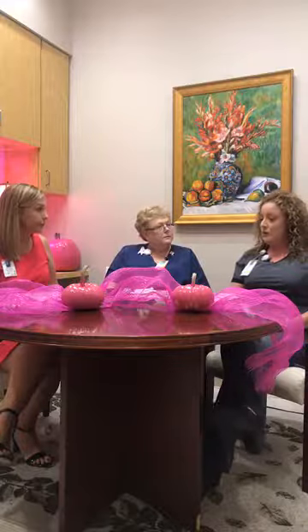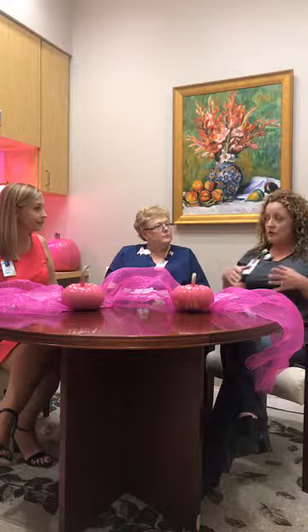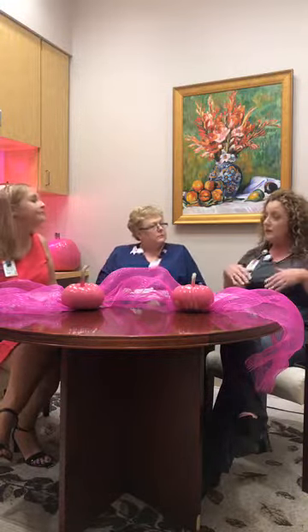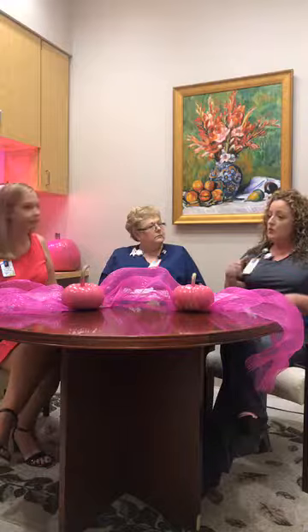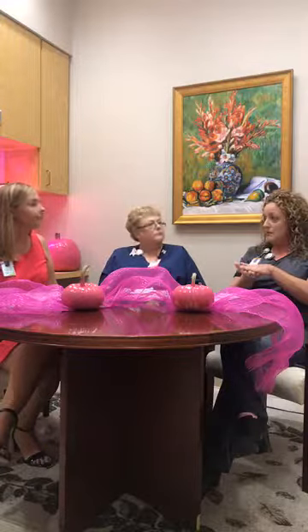So according to how the implant lies, the majority of the time we will do what's called displacement. We'll do one set of views, like I told you we do 4. We'll do one set of images with little or no compression that will include the implant, so we can visualize the wall of the implant and make sure there's nothing going on with it. Then we'll start over and do images where you're pushing the implant out of the picture and do just the breast tissue without visualizing the implant.